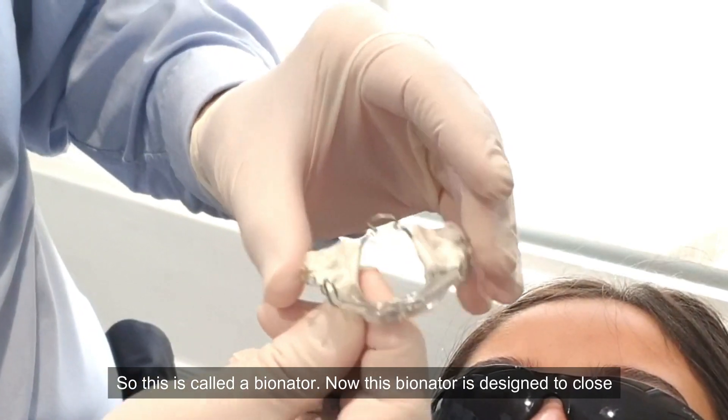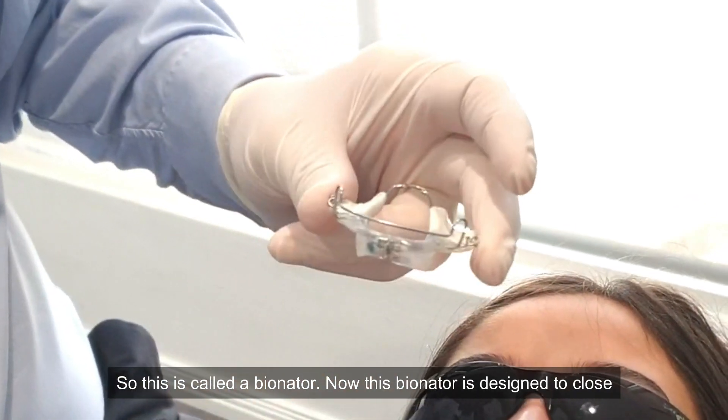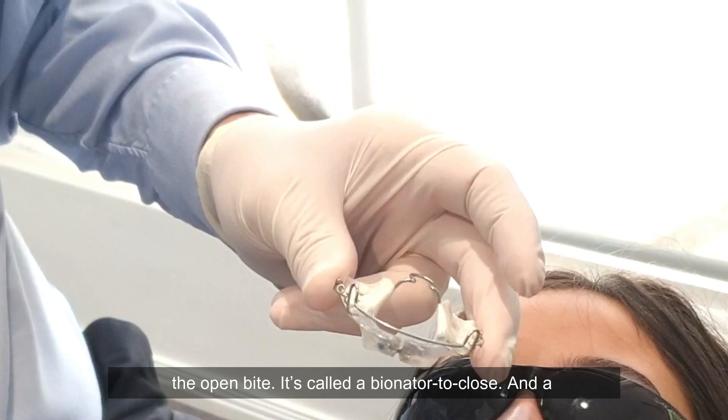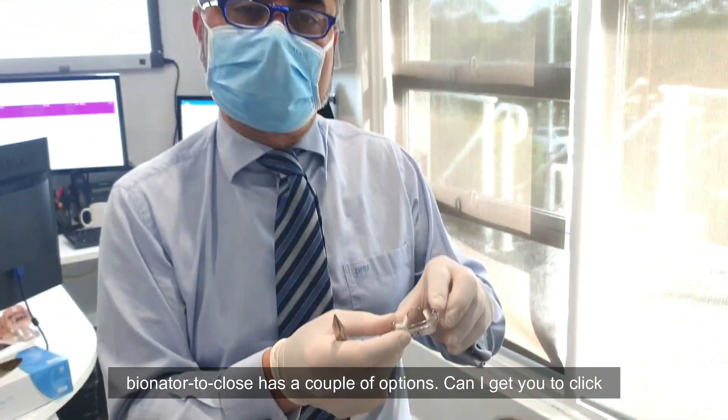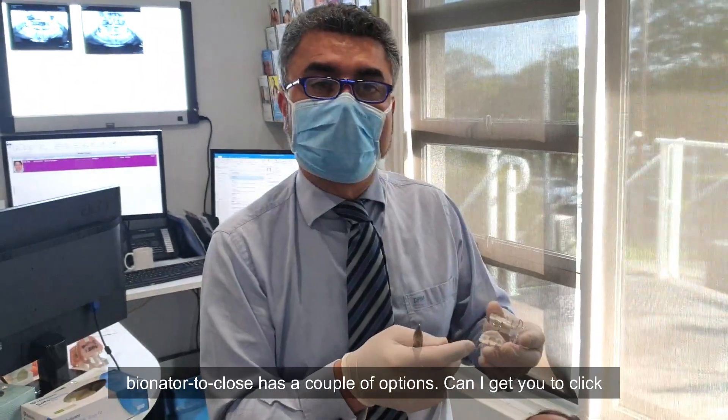So this is called a bionator. This bionator is designed to close the open bite — it's called a bionator to close, and it has a couple of options.